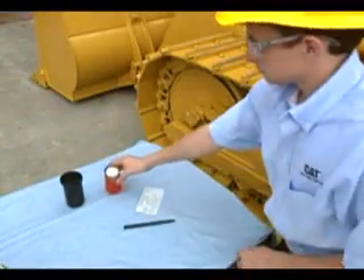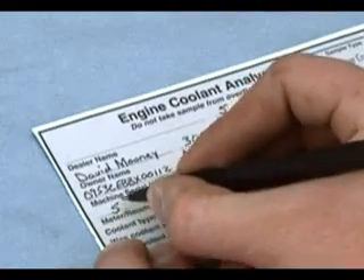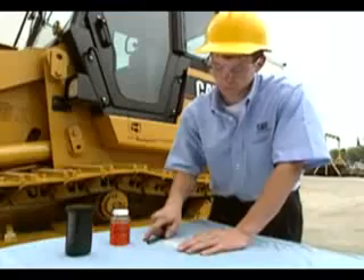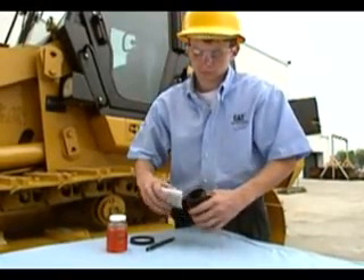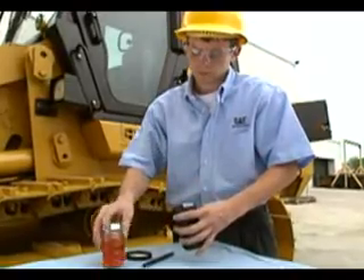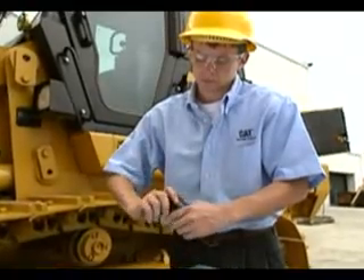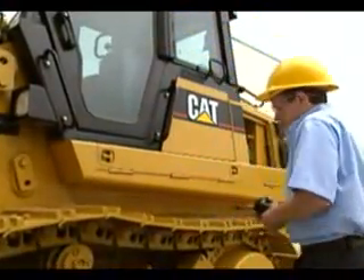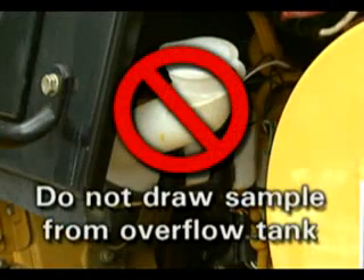Please make sure that you fill out the label completely. In order for your coolant to be analyzed properly, the hours, miles, or kilometers on the equipment and on the coolant must be clearly identified. Remember to send the coolant sample to the lab as soon as possible. If the sample sits for more than a week, some of the additives and contaminants may precipitate or fall out of solution. A sample should not be drawn from the overflow tank or from any cooling system drain valve, as these samples will not be representative of the coolant in the system.